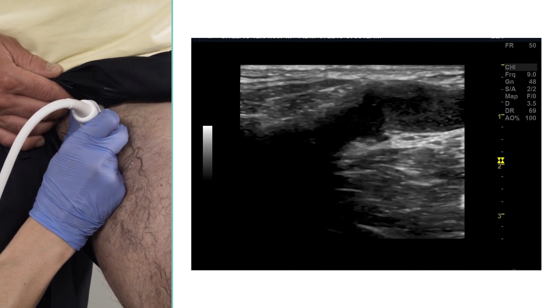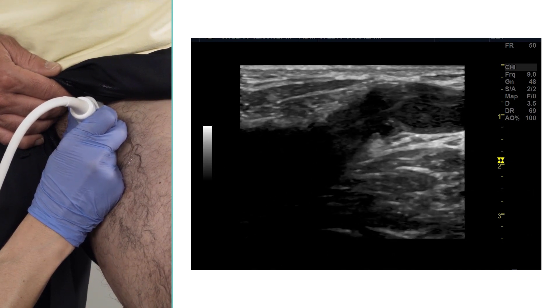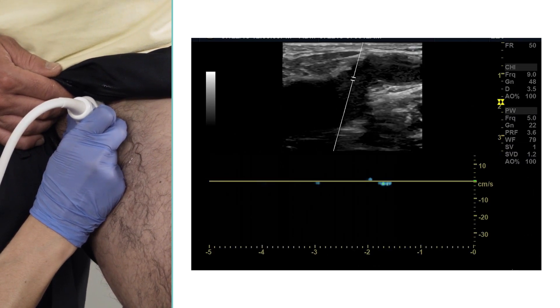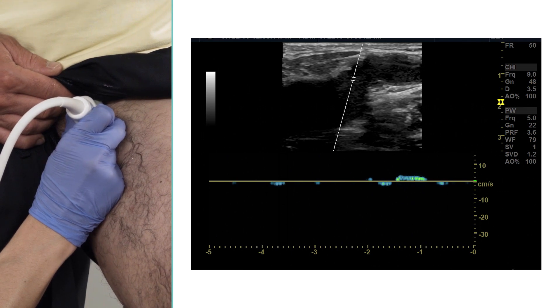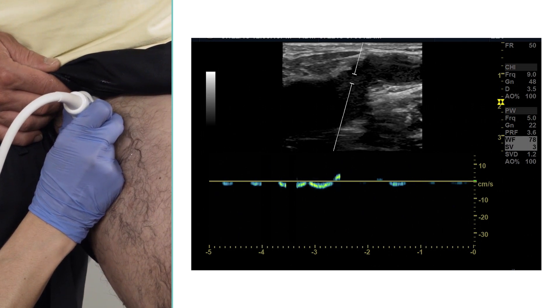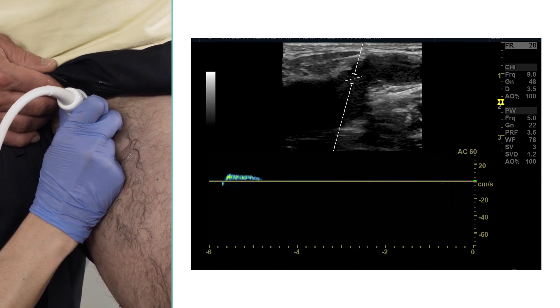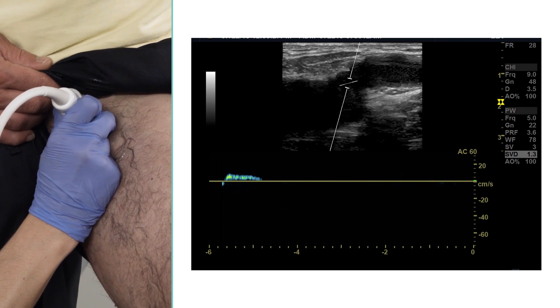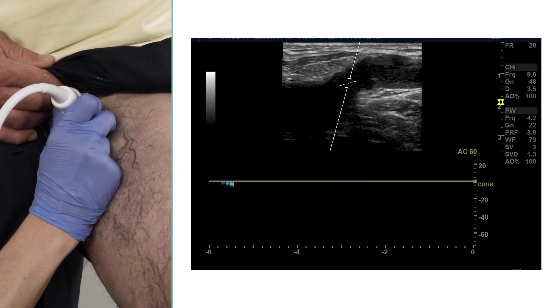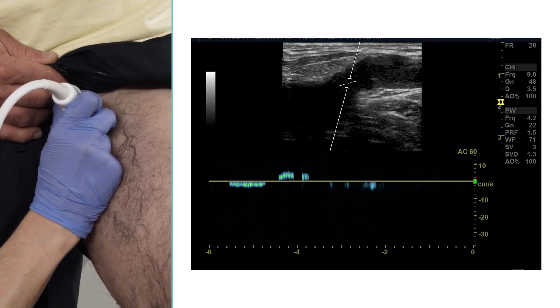In the longitudinal view, I will appropriately steer the beam of the cursor angle. I'm going to increase my sample volume size and set the correct Doppler angle to 60 degrees. I'm going to decrease my scale and my sweep speed.